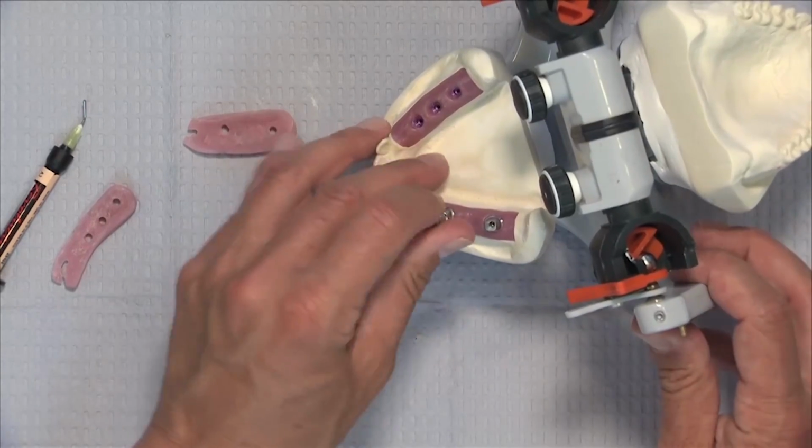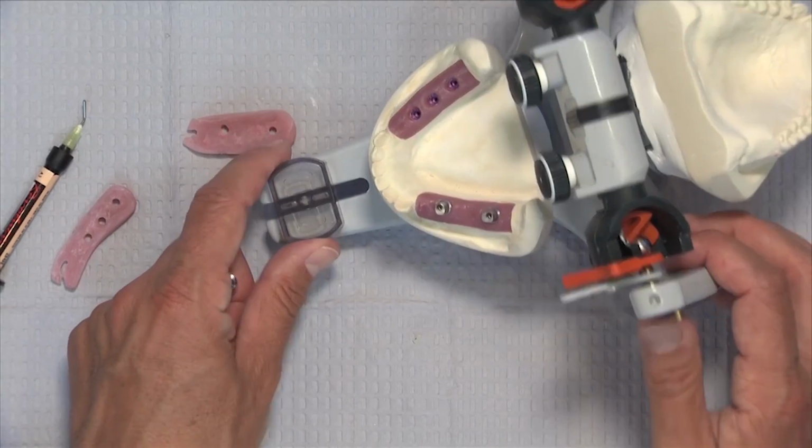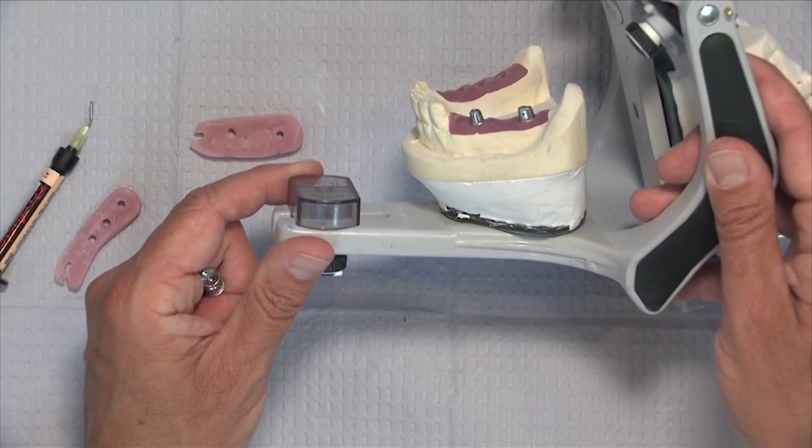Verify that the screws are in fact tightened, even though we already knew that they were, and just visually verify that they appear to be down. And in this case, we're going to snap another radiograph.